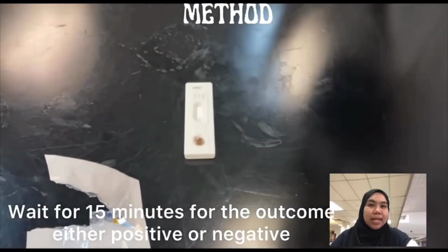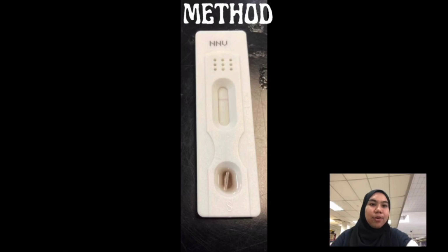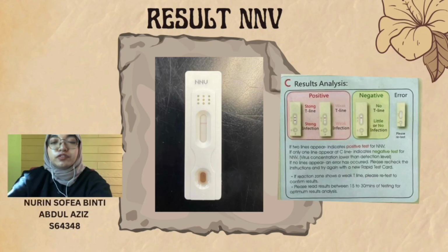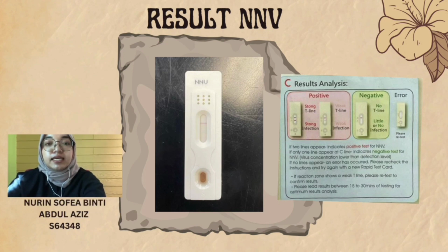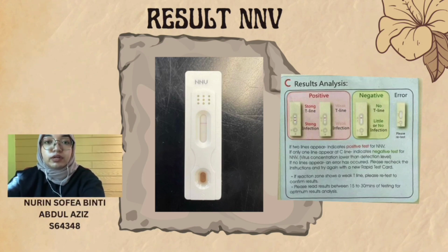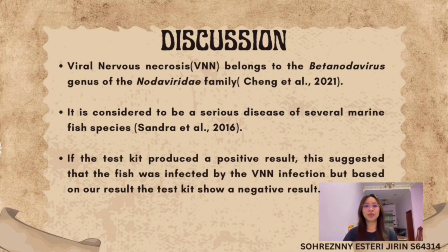Wait for 15 minutes for the outcome, either positive or negative. And in this lab, we got a negative result for viral nervous necrosis. For nervous necrosis virus disease, we use areolate grouper as our sample, and then we use its organ, which is the eyes. According to the result on the test kit, it has no T line. Thus, it is negative for the NNV disease. We move on to the discussion.